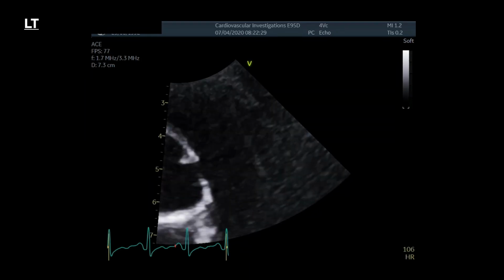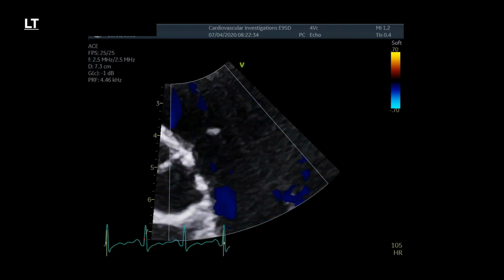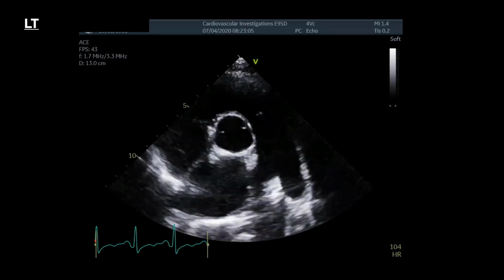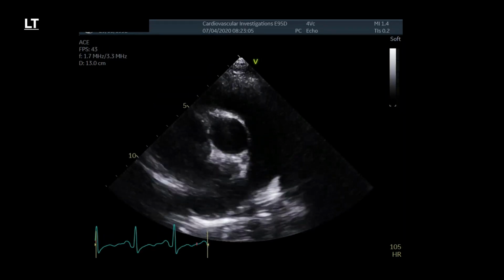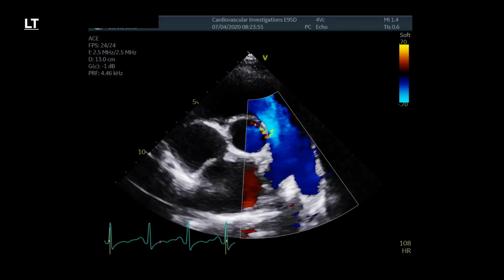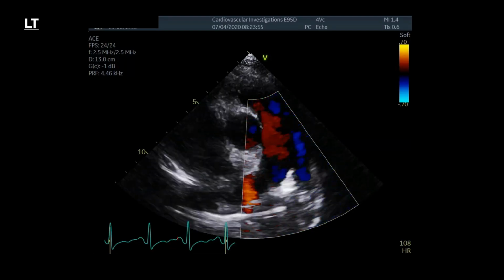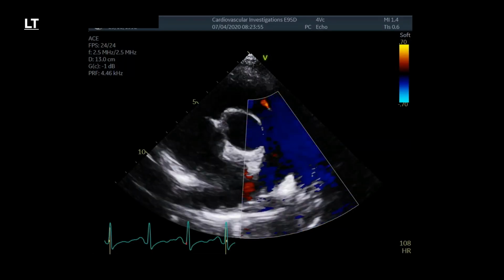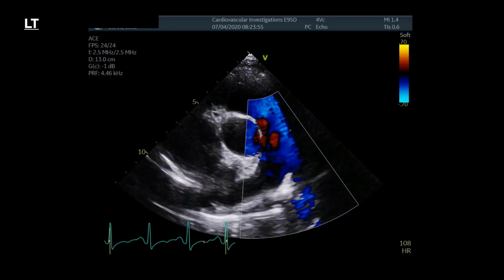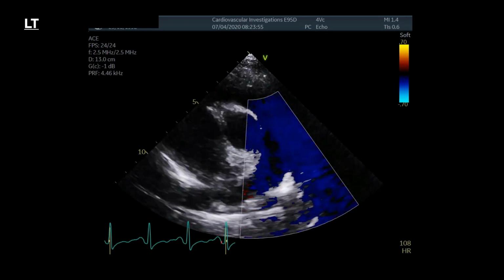And then again, just looking at the pulmonary valve, colour over the pulmonary valve, and there's a small flash of PR there, which is very common. And just zoomed back out again, and some colour zoomed out, and you can see these are really lovely images. Not only that flash of PR, but you can actually see the right and left main pulmonary arteries there. And if you're really unlucky or lucky one day in your career, you might see some clot sitting there as a saddle embolus.